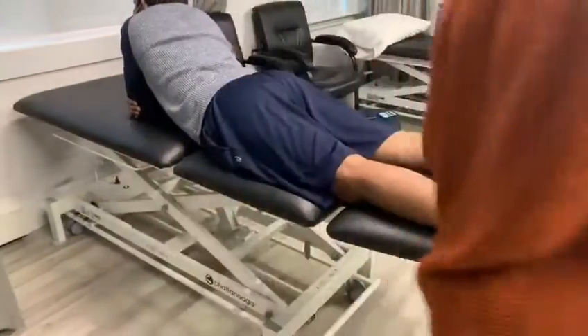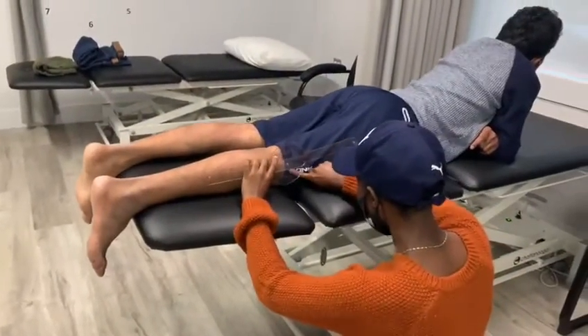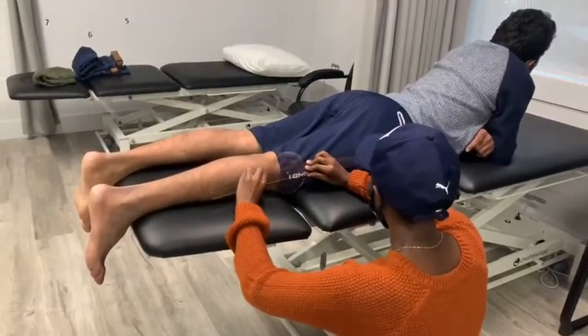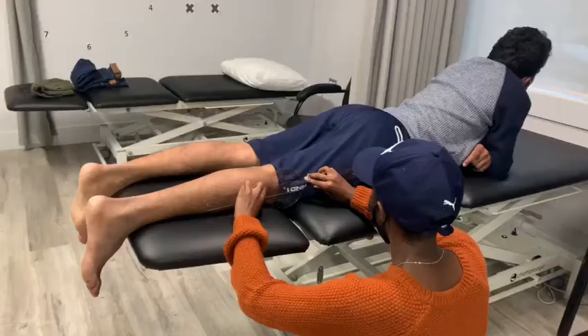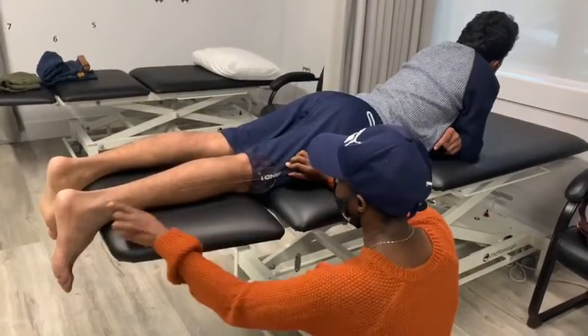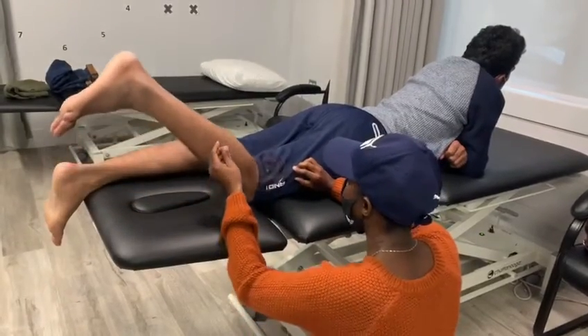And now we're going to try it on the other side, the affected side. Same landmarks here — the lateral epicondyle of the knee, the greater trochanter for the fixed arm, and the mobile arm with the lateral malleolus. Bring your heel up.